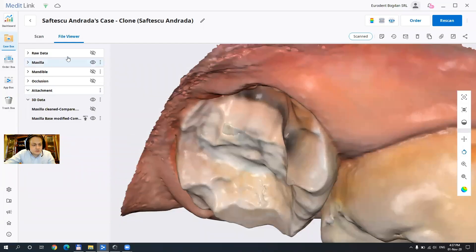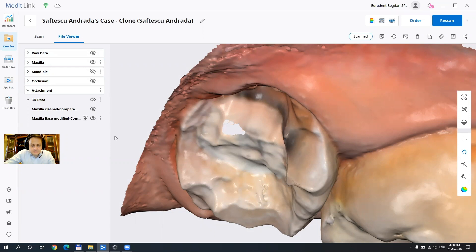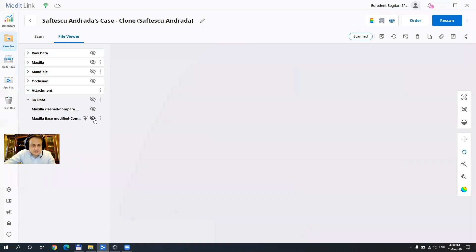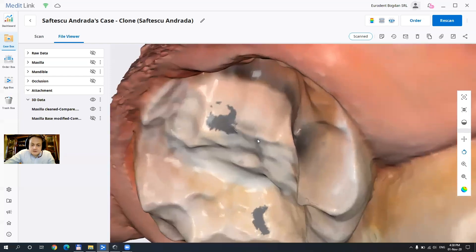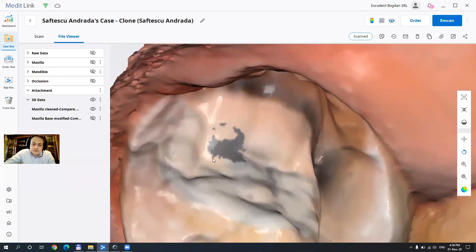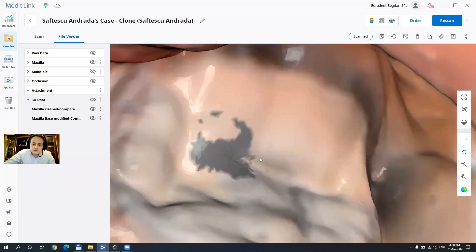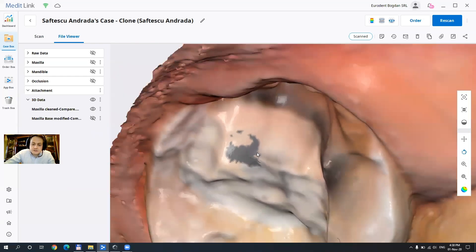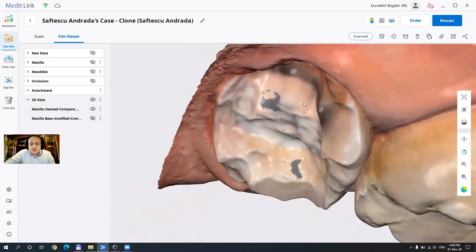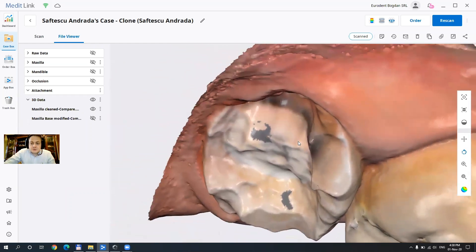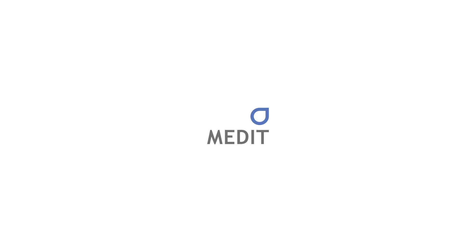And we're gonna see that this part here got the corrections that we need and now we can send it to print or mail. Thank you guys I hope you liked the new tool and that you are going to use it as much as possible. Have a wonderful day.